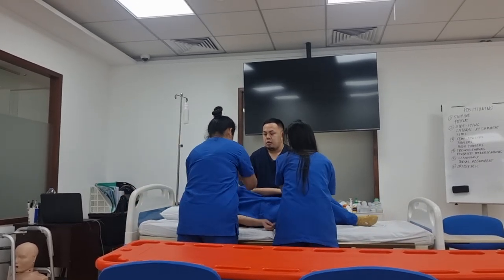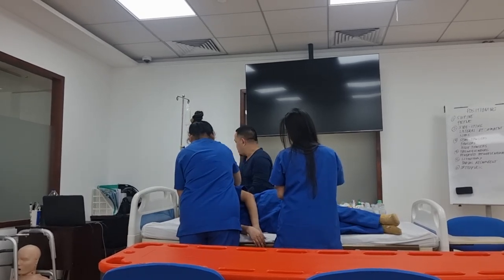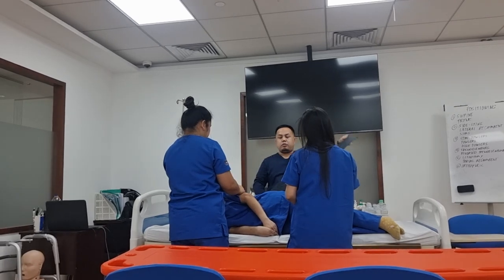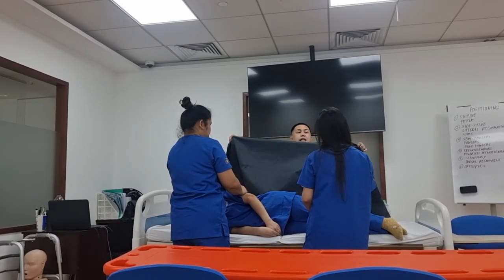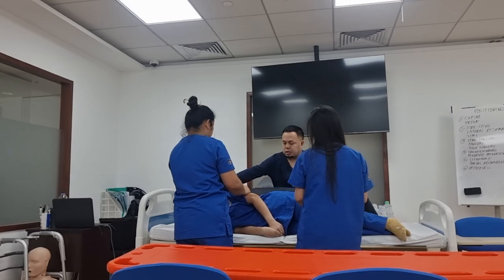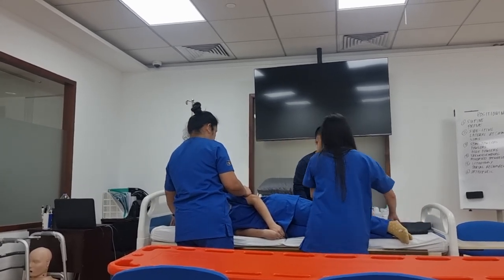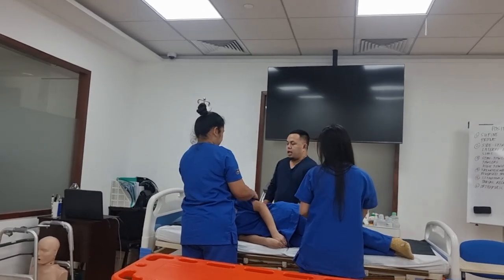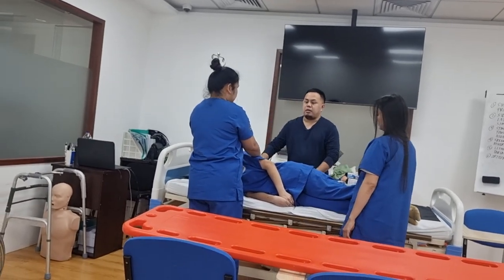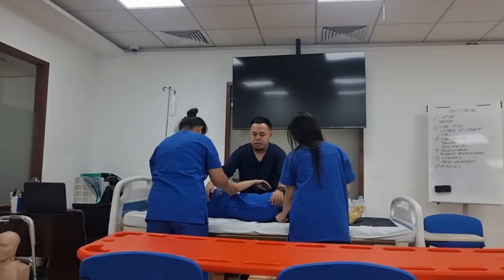Ask your colleague: 'Can you help me roll the patient towards you?' Then remove the pillow. Once the pillow is removed, get what we call the slider sheet. Spread the slider sheet to the side where you are standing, then ask your colleague: 'Can you roll the patient towards me?'